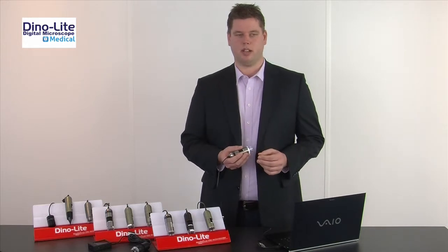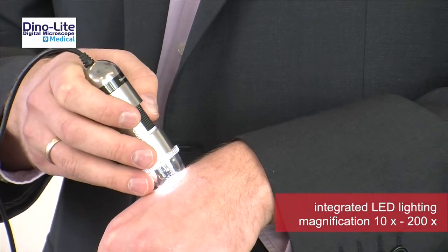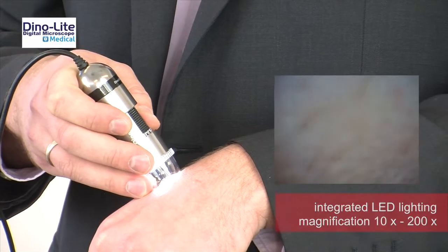I'll give a short demonstration of how to make an image with the Dynolite Dermascope. The lights are integrated. I can adjust the magnification between 10 and 200 times by adjusting the focus wheel.